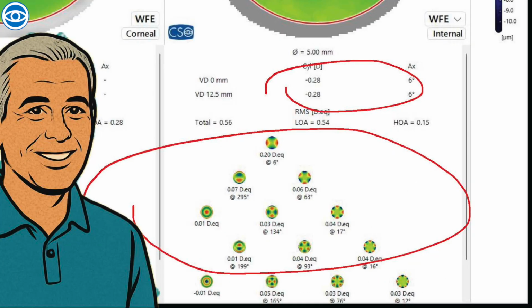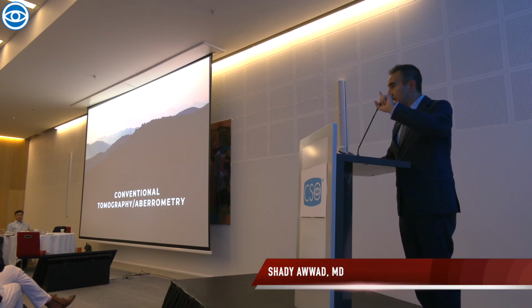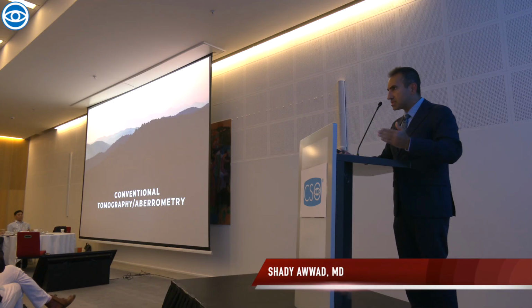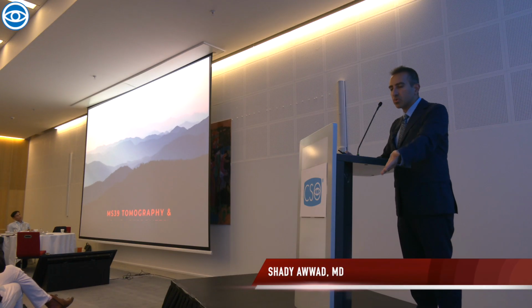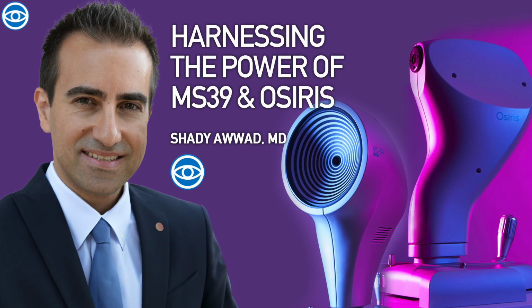The patient is extremely happy. So the whole point is when you have those two combinations, I mean, it took us a lot of time to transition from Placido to Scheimpflug. Not to say I still believe Placido is superior to Scheimpflug in the anterior cornea, but combining them like this series is amazing. But remember how much it took us and later our colleagues to transition. But now with this, it's a no-brainer why we shouldn't transition. This is what you see when you have the new devices. You see way beyond. You see things that you never thought you would. Thank you.